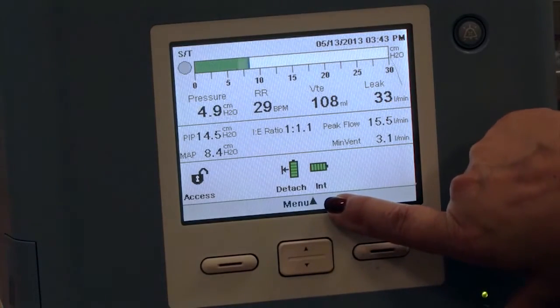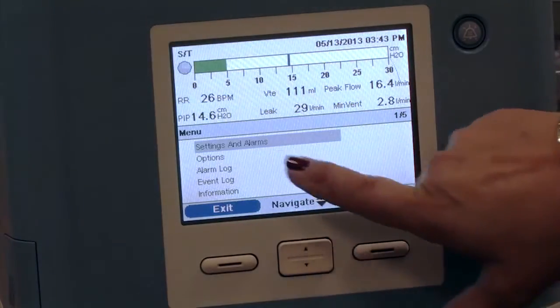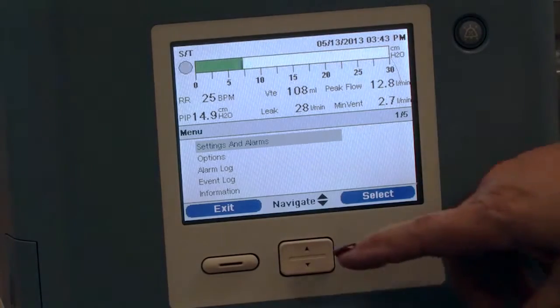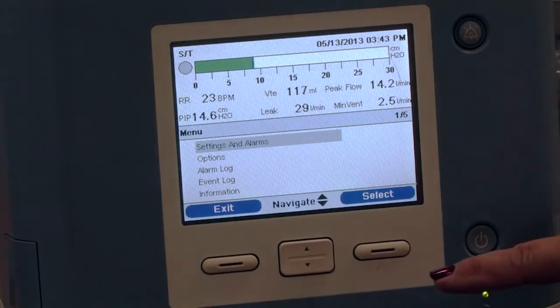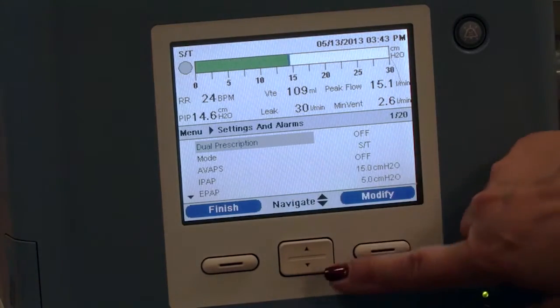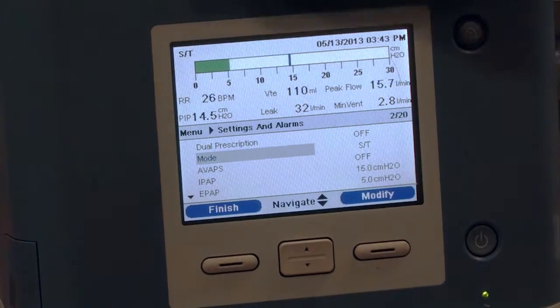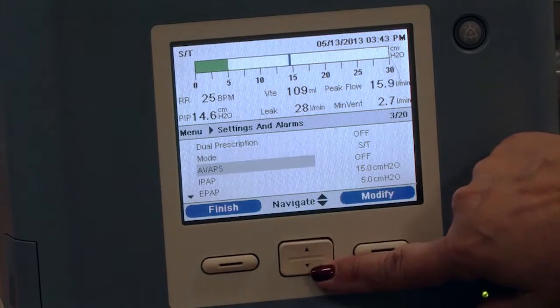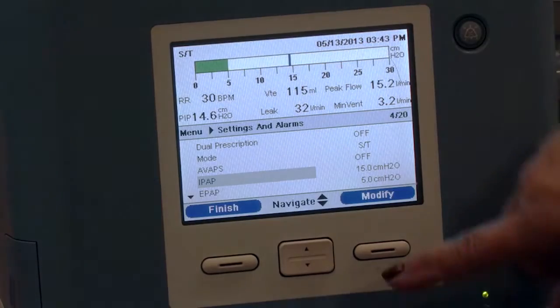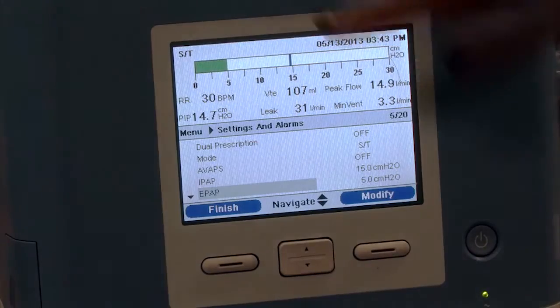So we're going into the menu up button right here. We'll go into the menu and we're going to go into settings and alarms. If the machine is in the limited view, you will go into the information button to get your information. But here we can go into settings and alarms. We're going to select them, and we're going to see that our mode is ST, which was visible to us on the face screen of the machine. We have an inspiratory pressure of 15, as we noted from the screen out front. We have an expiratory pressure of 5.